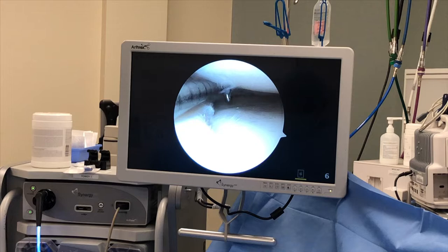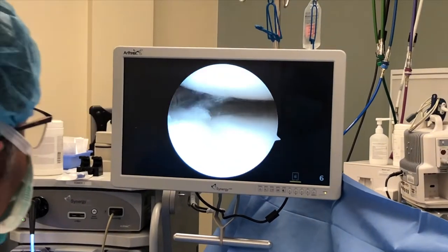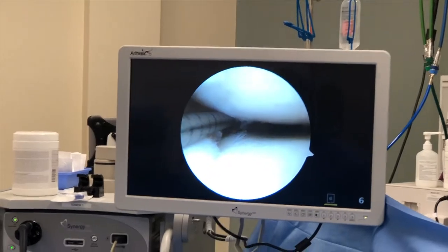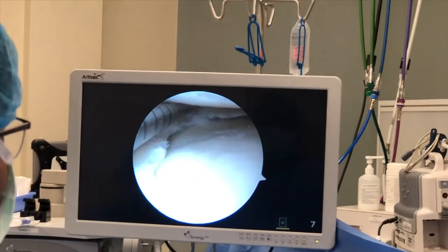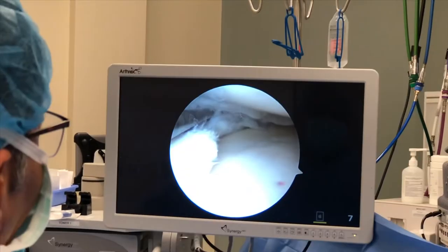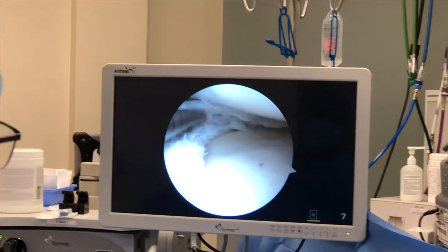So I got my probe in here, and you're pretty awake right now, right? Absolutely. And I'm going to show you — they're right there. So this is one of the tears right here. I'm going to trim that in a minute. How are you feeling overall, Adam? Excellent.